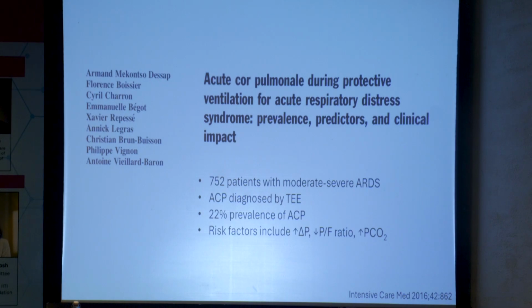So this is relatively new technology. This is not standard of care for right heart dysfunction, but this is a consideration for right heart dysfunction. And then we have this population of right heart dysfunction associated with respiratory failure, which became more evident when we had a lot of respiratory failure with COVID in 2020 and 2021.